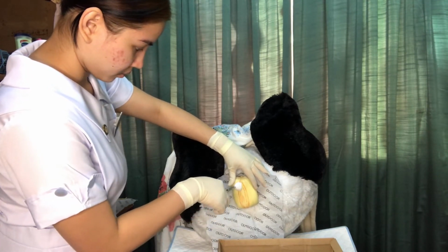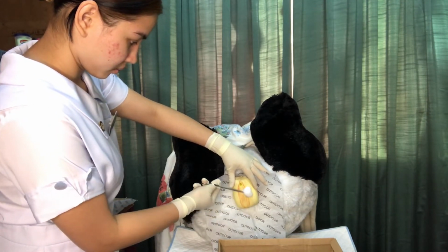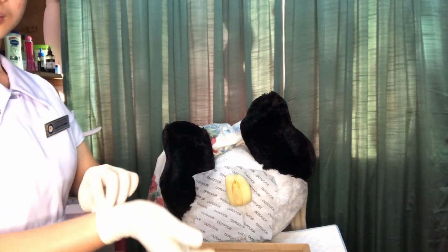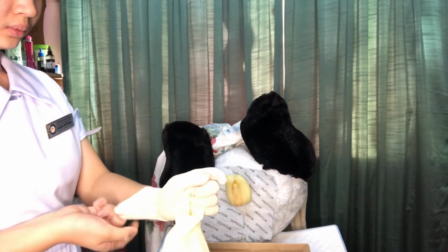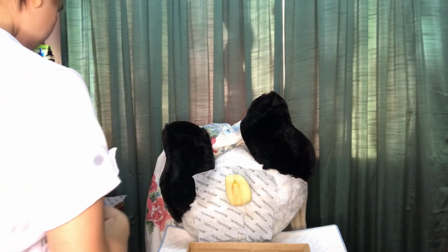So bear with me if I'm holding the sponge like that, because the sponge will fall off if I don't hold it like that since it was just clipped, and this one is improvised. So after cleansing the urethral meatus, we're going to dispose of the gloves that we used and replace them with another sterile glove. So before that, don't forget to wash your hands.